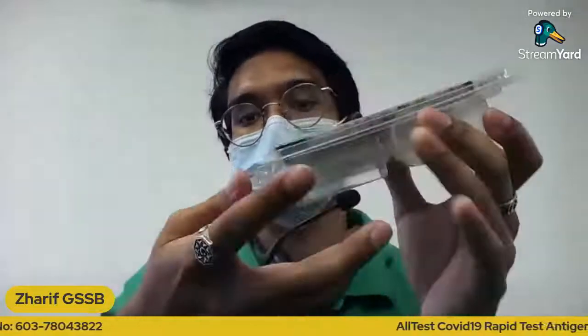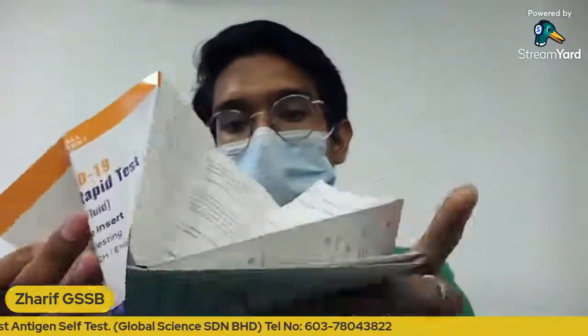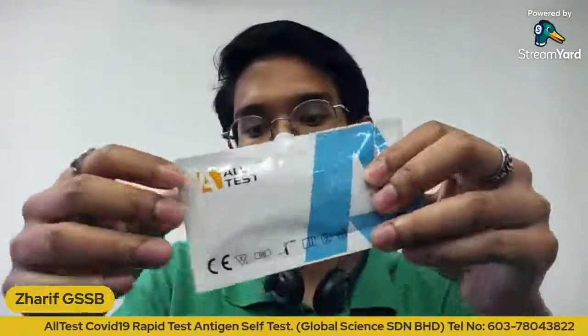Alright, I'll begin straight away with the demonstration. Here, you can see the label to open. You just open it right there. Inside the package, the first thing you will see is the package insert, which contains the summary regarding the test kit as well as the steps for you to do. You can check the package insert if you're not sure. The second thing is the test device, which is inside the pouch.